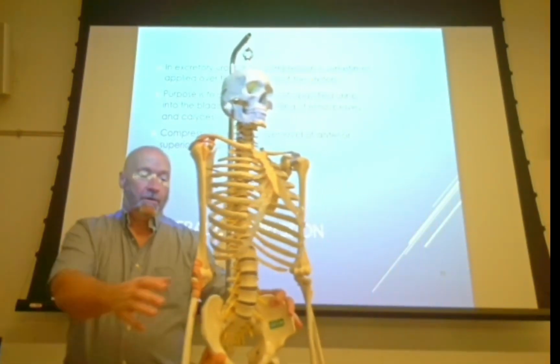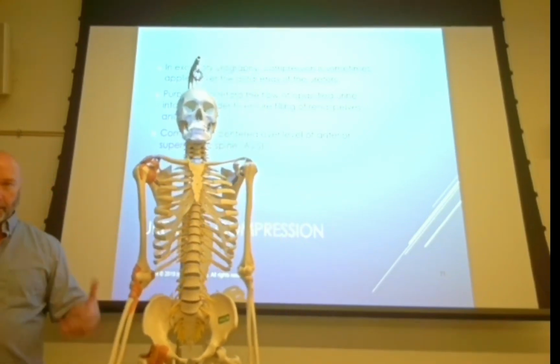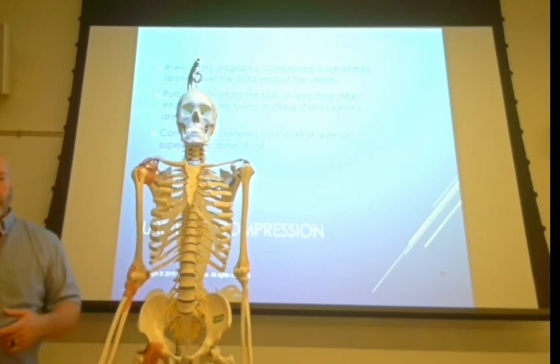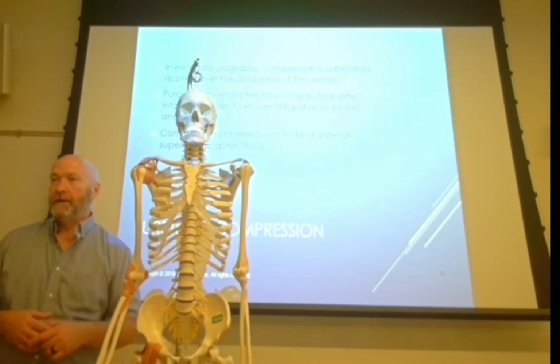So what we do is we inject the patient, we do a scout. A scout is just a KUB, and we're just looking for placement of the kidneys. Do they have an ectopic kidney? Whatever, right? So we do the scout, we inject the contrast, and then we take what we refer to as a 0-minute or an immediate image.